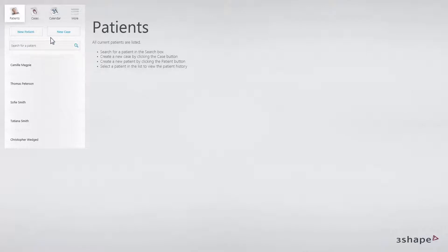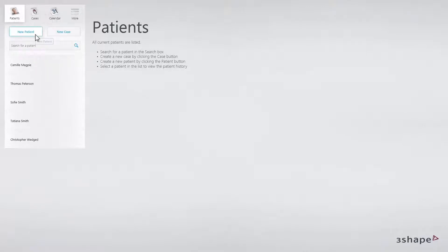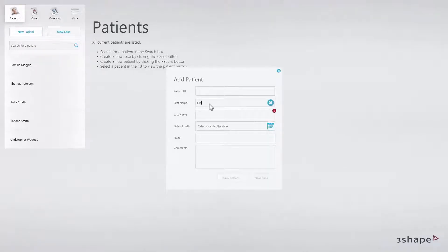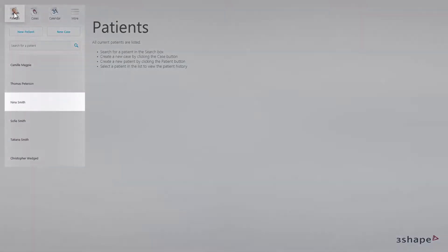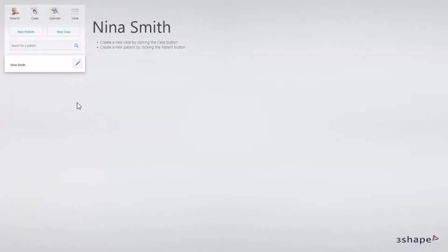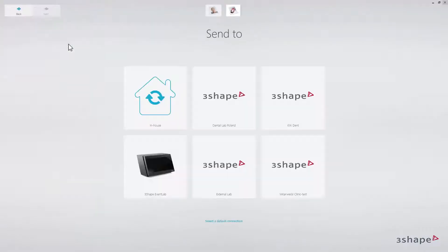To create a new patient, click on the New Patient icon and fill out the required fields. The patient will appear in the patients list in the upper left corner. To create a new case, choose the patient from the patient list and click the New Case icon to create an order.